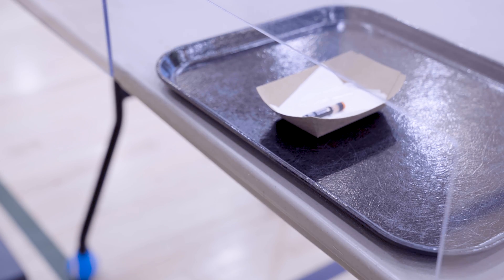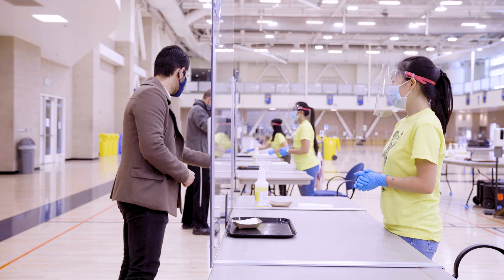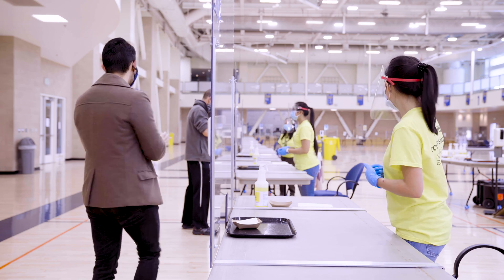The attendant will take your sample. Replace your face covering and use hand sanitizer when you're done. That's it! Thanks for being part of the solution here at UC Davis. Enjoy the rest of your day.